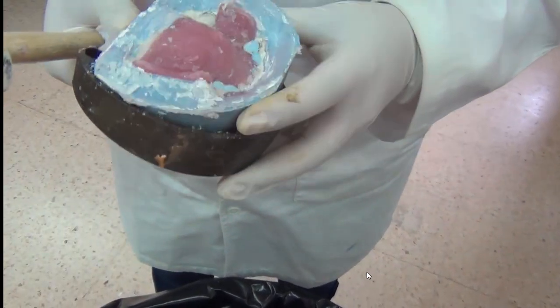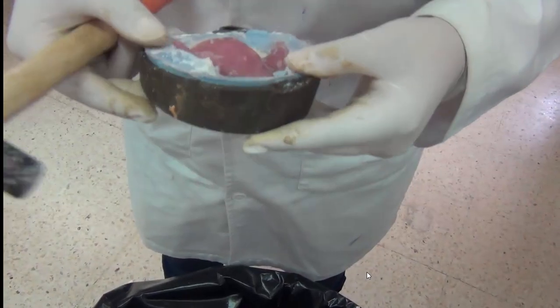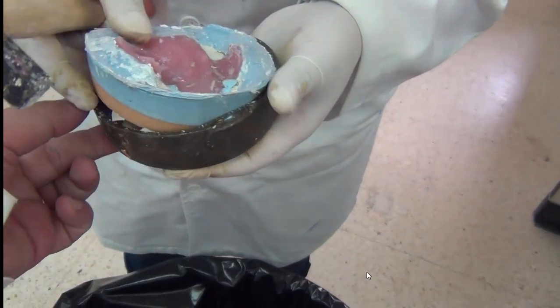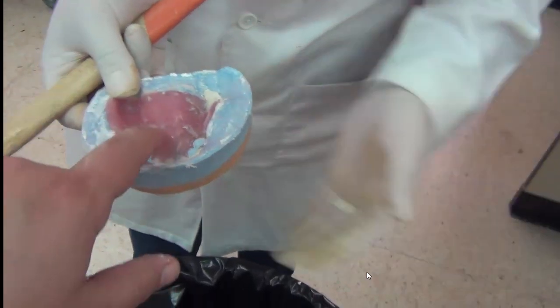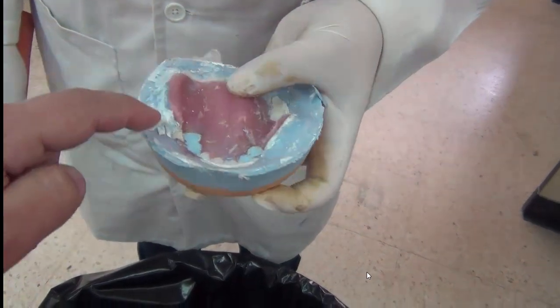And if it's not separated yet, if it was still in there and the hammering was not sufficient, we try to hammer on the margins of the metal until the metal separates, because once more the metal is more resistant to the knocking effect. Okay, so we remove the material. Now this is very important. Now we want to separate the denture and we don't want it to fracture. So we concentrate first on removing this side.